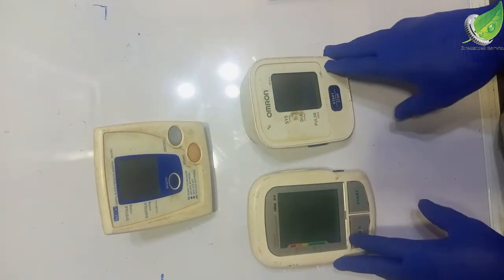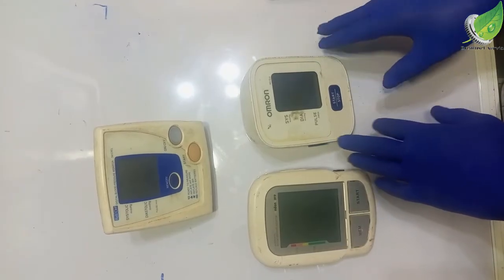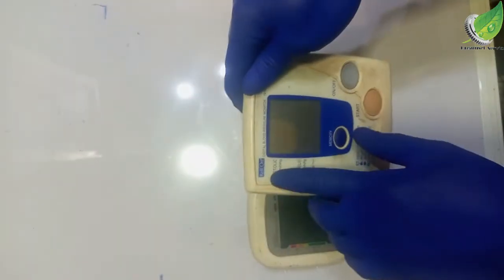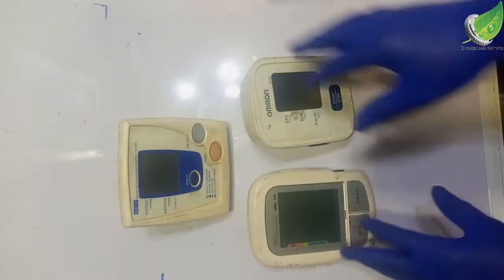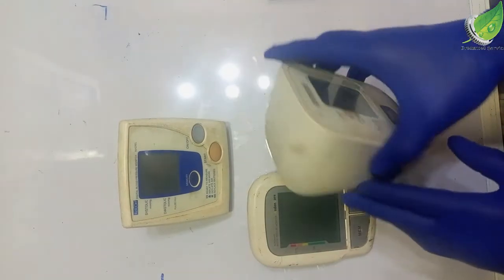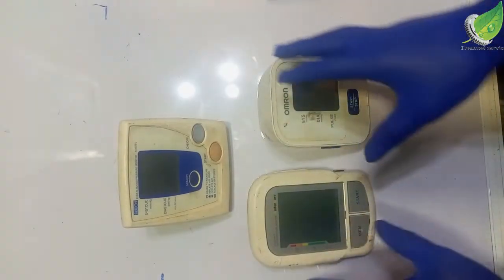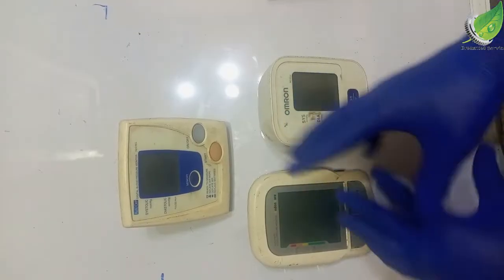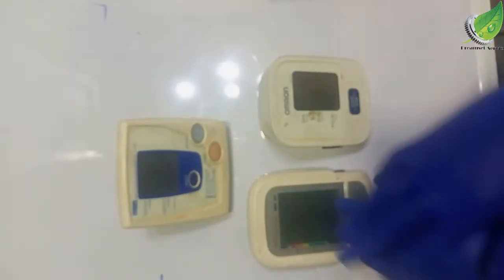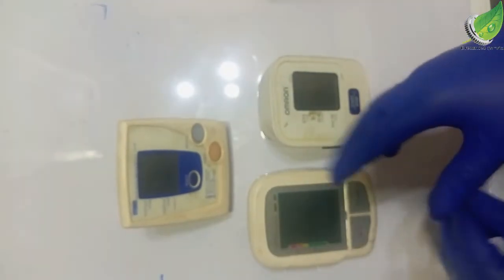All right, I have 3 machines here with me. I have this digital blood pressure monitor from Omron, I have this from Andon Care, and this is from Relion. So basically they all work with the same mechanism. So if you learn how to fix one, you'll probably be able to fix the other ones. It's just minor differences, like where the buttons are positioned and how many buttons. But basically the mechanisms are the same. So let's start with the problem of E1.